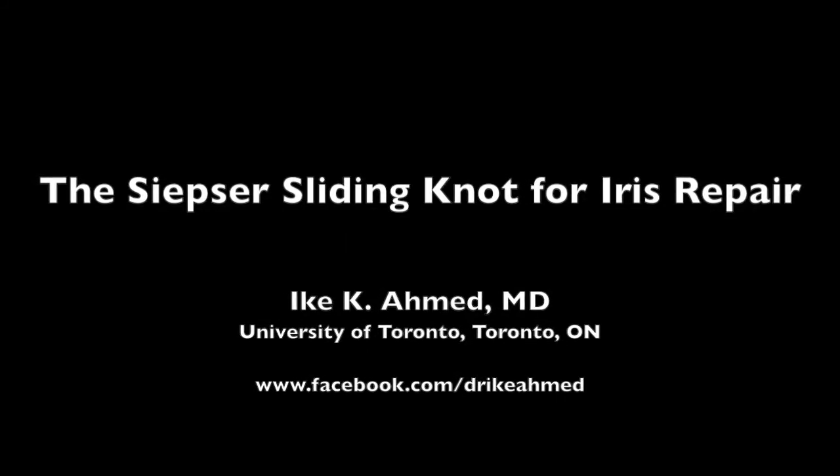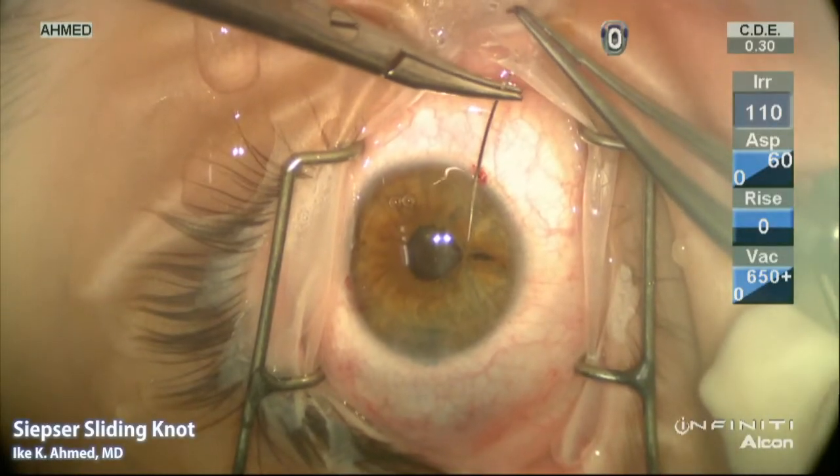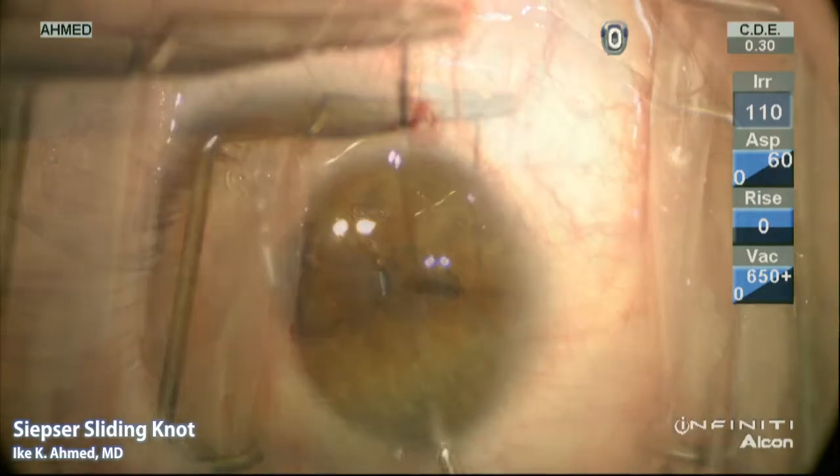This video describes the Siepser, or sliding knot technique, for iris repairs. We are using a 10-0 Prolene on a curved CIF-4 needle.